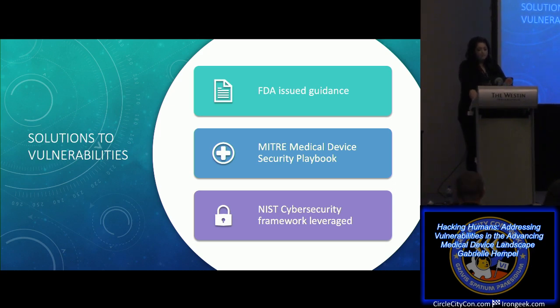The FDA is also leveraging the NIST cybersecurity framework. It's composed of 5 core functions: identify, protect, detect, respond, and recover. They've also been assembling information sharing analysis organizations and holding forums. Finally, they've been partnering with Department of Homeland Security in order to mitigate wider attacks.